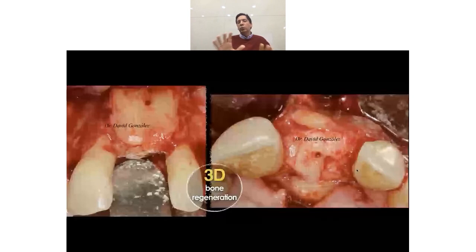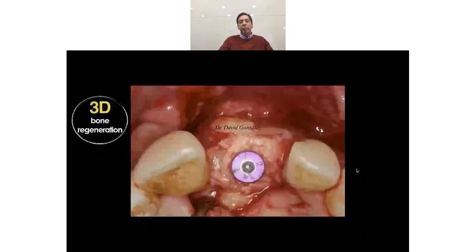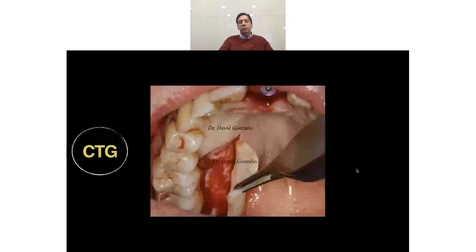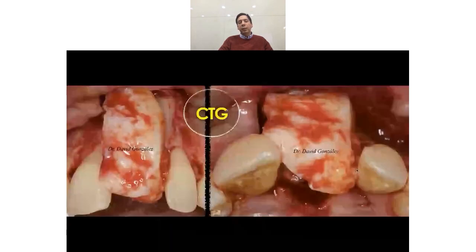When I try to regenerate some alveolar dehiscence on the adjacent teeth, I leave a longer healing period of 6 months. Then I placed the implant, frontal view, incisal view, and then I go to the palate, and I get this big CTG.